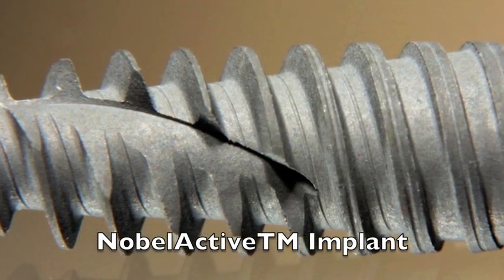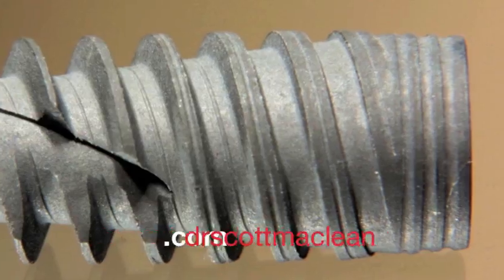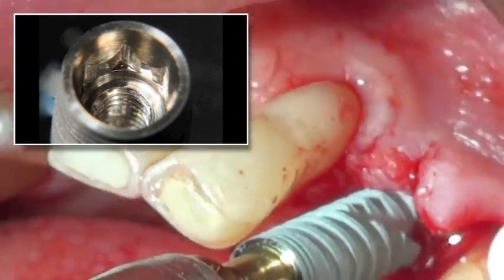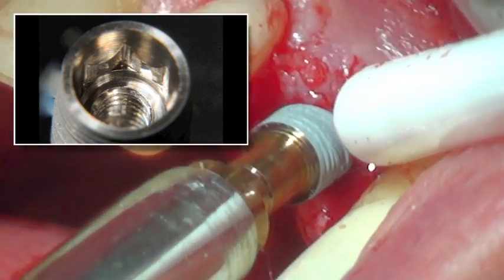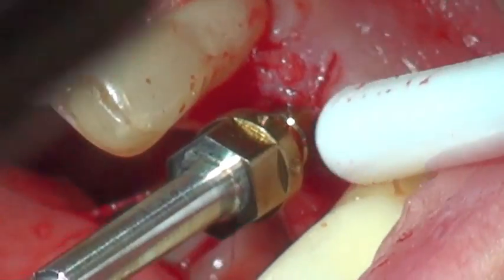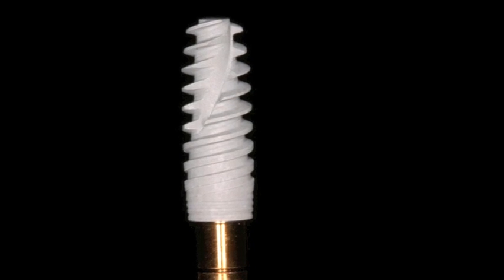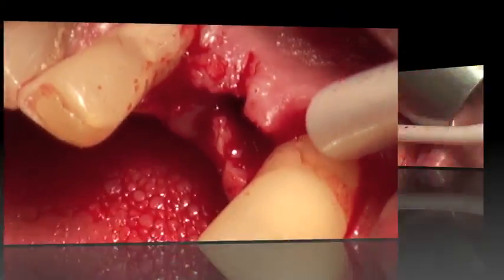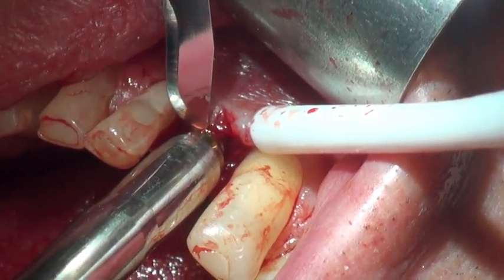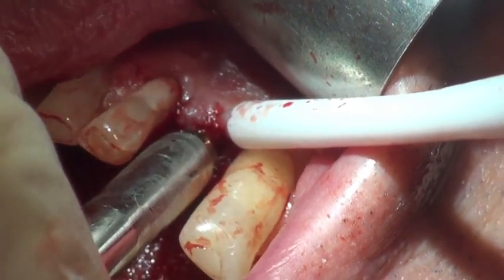Now it's time to get the implant ready. We're going to use a Nobel Active narrow platform 3.5mm implant for the great stability it offers. The implant has bone-preserving properties — it has a platform shift on top of 0.25mm with a conical seal and an internal hex. We carry it to the mouth with a surgical driver, which allows placement in a very accurate position with real tactile feel. You have to be careful not to exert too much force, but the driver works very well. Once the implant is at the proper level, we know we'll have enough crown height space and sufficient torque.